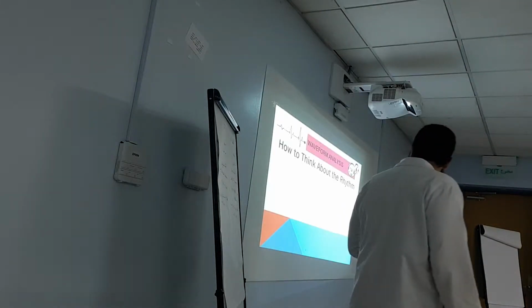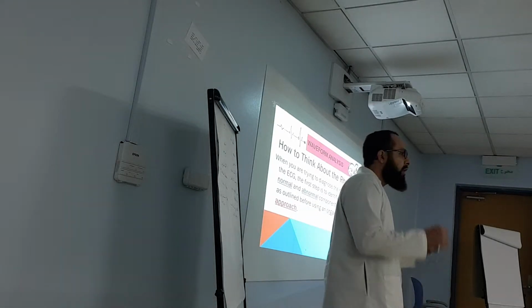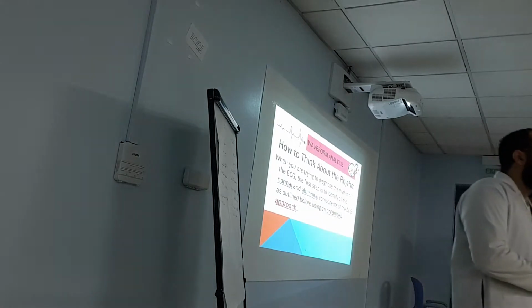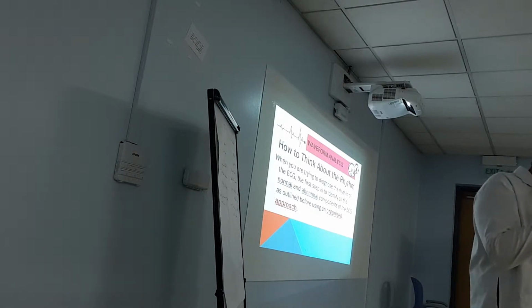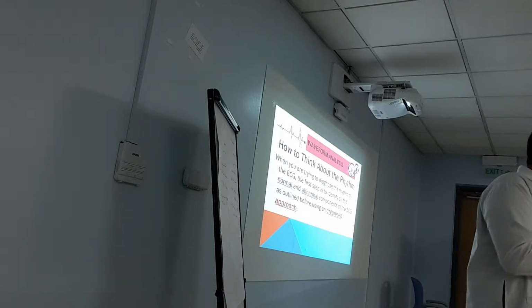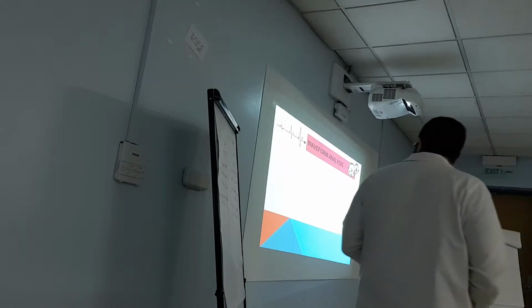Let's go in detail now. Before you have diagnosis, this is AF, this is ventricular tachycardia, this is PVCs, isolate the abnormalities first. You have a checklist. You need to make a checklist for your ECG, especially the one printed. Just study, okay? These steps.